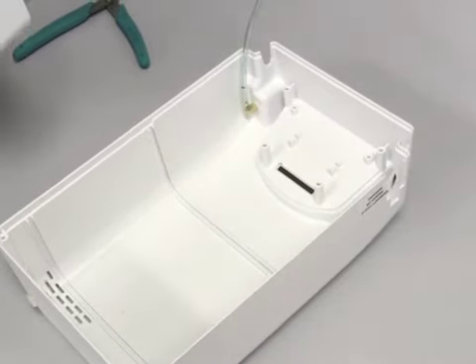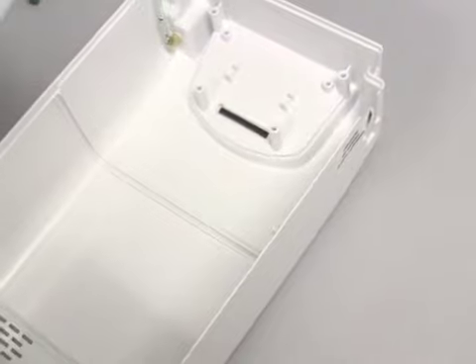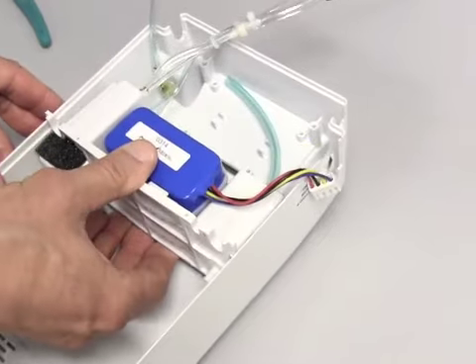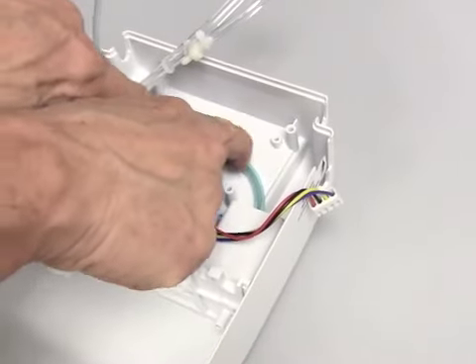Alright, the next step is to put the reservoir back into the POC, into the retaining slot in the case. This is done by taking the reservoir and sliding it in place. And then the intake tubing should be placed back in the tabs on the case.